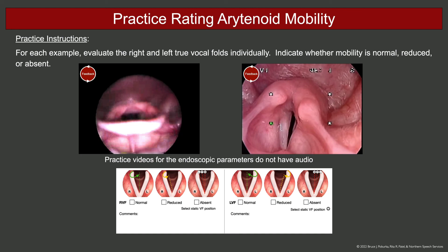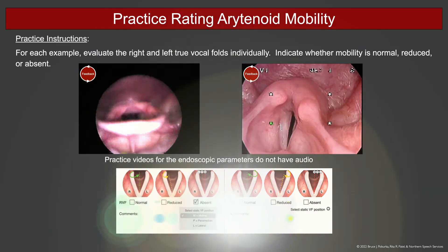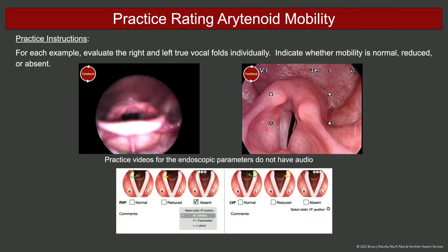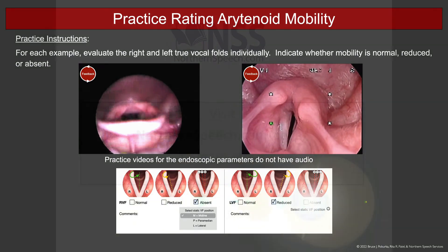In this example, the patient's right vocal fold should be marked absent, with the position of the static vocal fold being midline. The patient's left vocal fold should be marked reduced.